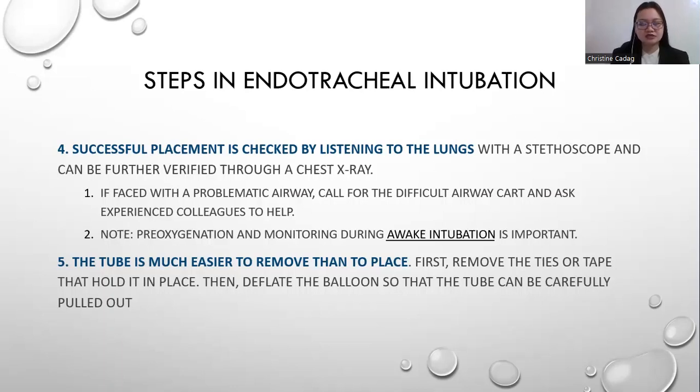And then as nurses, you need to prepare all the equipment needed in case of any possible reintubation. Also, you need to prepare at the bedside O2, nasal cannula, ambu bag, suction tip, those kinds of things. And also an ETT of the same size, if the patient will not be able to tolerate the extubation process.